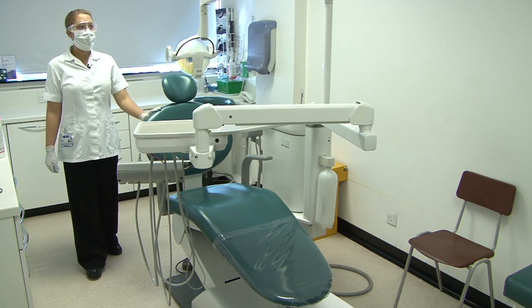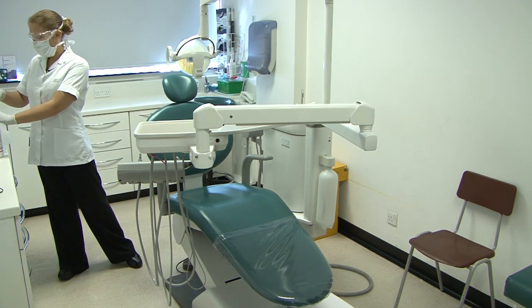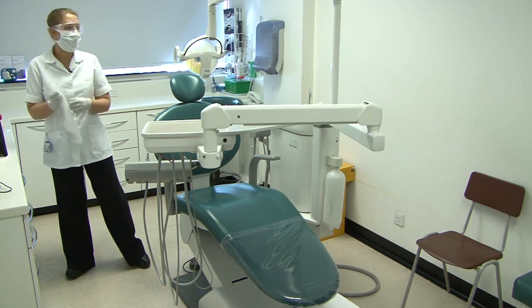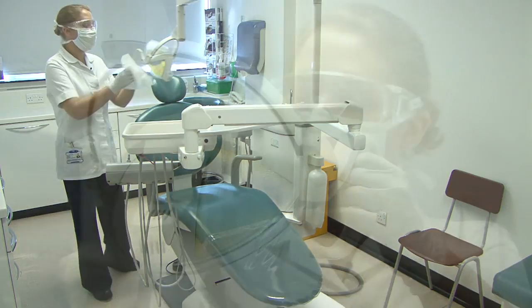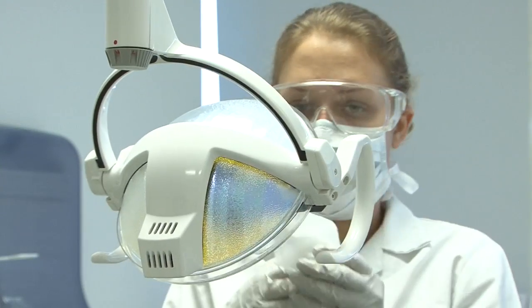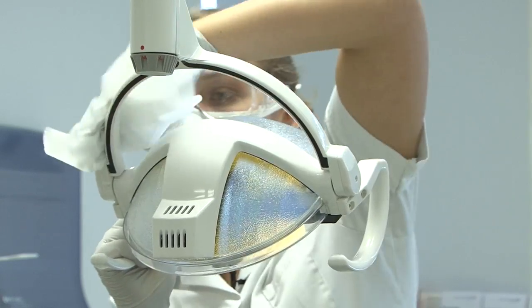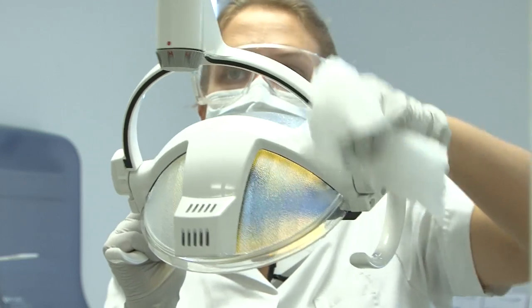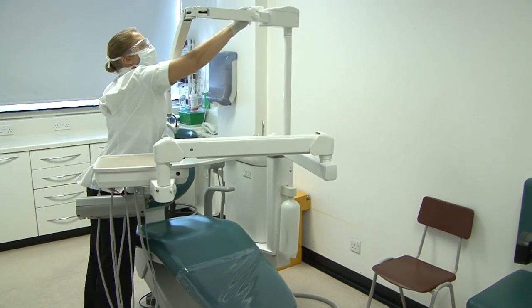When we disinfect the chair we do it in sections. For the hard surfaces on the chair we use azo wipes again. I personally start with the light — I do the handles on both sides of the light, the supporting bar and the back of the light, then go up and across the arm of the light.